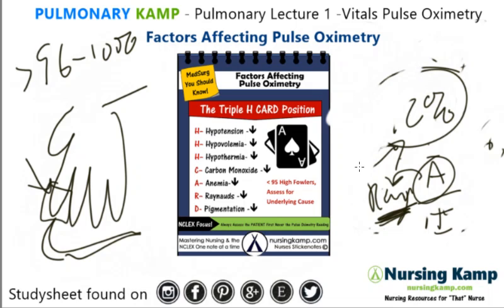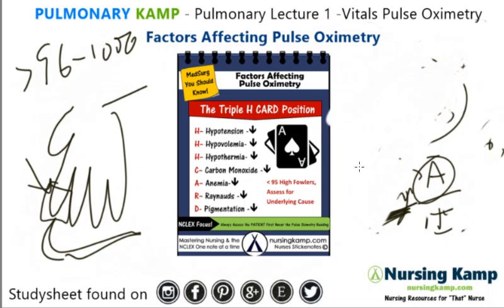And the last thing is pigmentation. If there's changes of pigmentation on the skin, you might want to reposition that pulse ox.